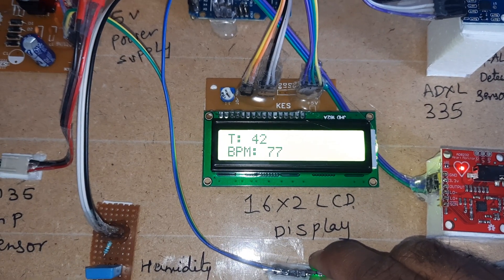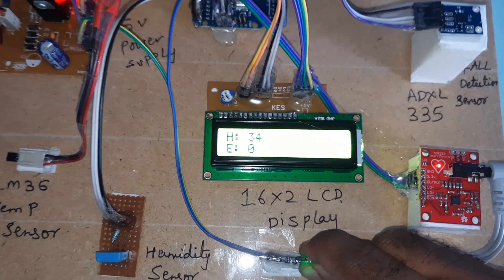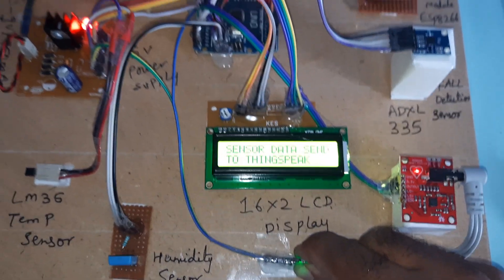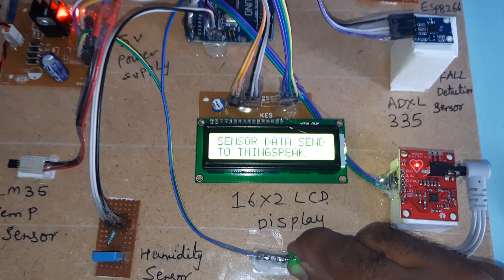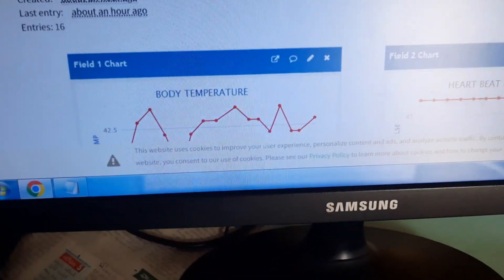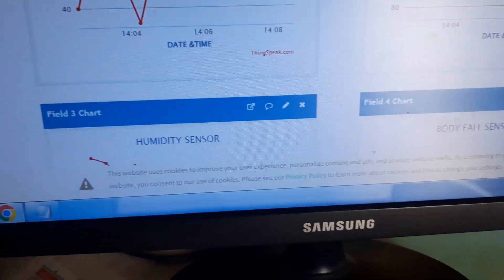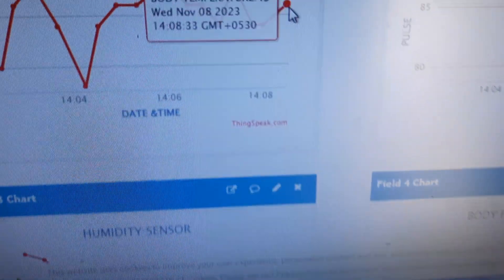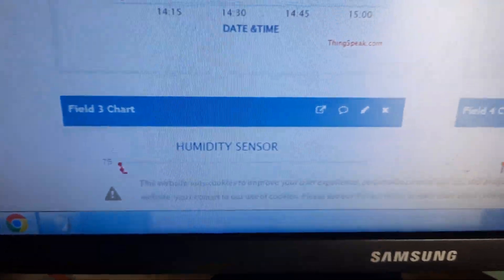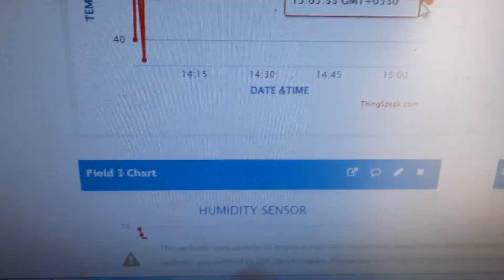Heartbeat reading is 77 BPM. The system is sending data to ThingSpeak and updating onto the ThingSpeak cloud. The time is 3:05 and the values are now updated successfully.